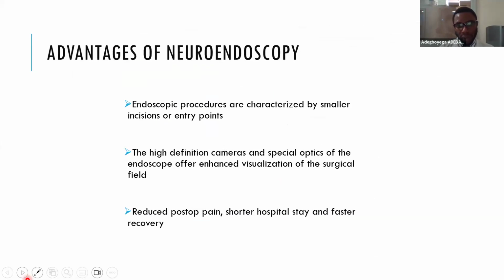What are the advantages of neuroendoscopy? Endoscopic procedures are characterized by smaller incisions or entry points when compared with traditional open neurosurgical procedures. This minimizes damage to normal brain tissue and ultimately translates to reduced post-op pain, shorter hospital stay, faster recovery and return to normal activity, as well as cosmetic scars. Furthermore, the high-definition cameras and special optics of the endoscope offer enhanced visualization of the surgical field, which facilitates precise lesion targeting and minimizes damage to adjacent normal brain tissue.